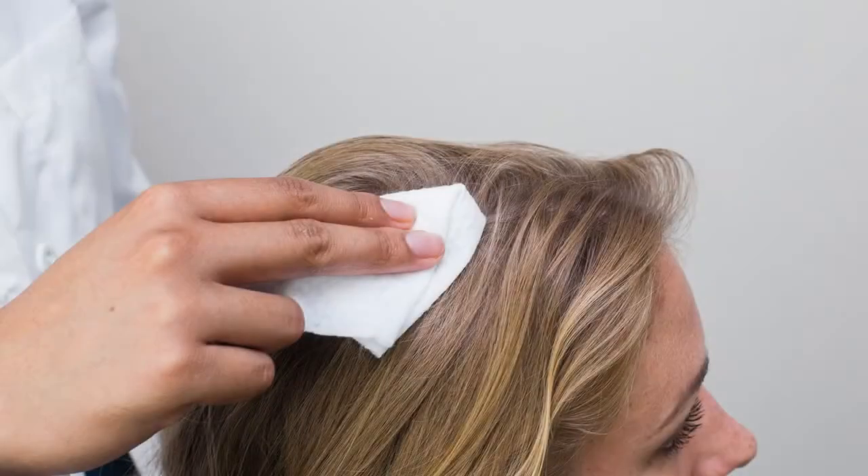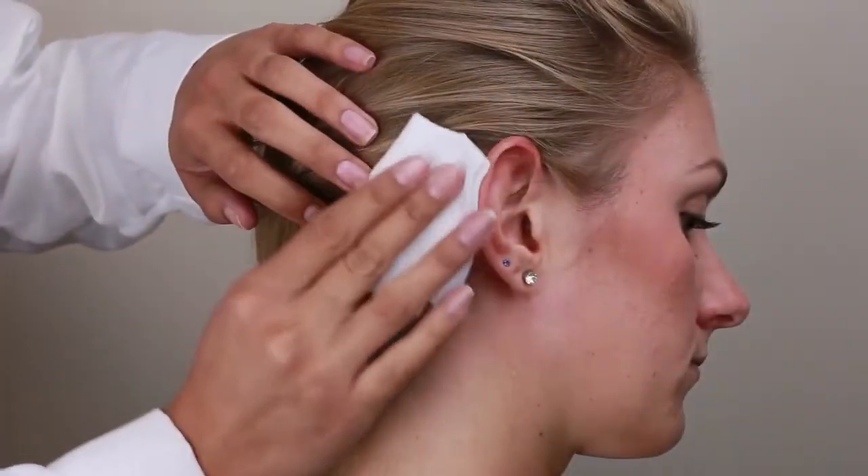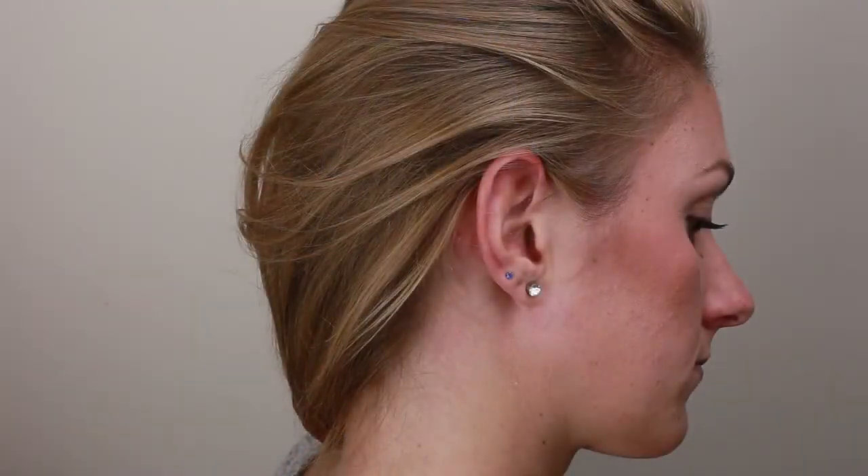Wipe the participant's head with an alcohol swab, making broad and thorough strokes across the scalp, all temporal sites including the forehead and the mastoid bone sites behind the ear, taking care not to cause physical distress to the participant. The alcohol swab is used to remove dirt, natural oils, and hair product residue. This helps reduce impedance values between the scalp and sensor sites. We recommend asking the participant prior to the data acquisition session to refrain from using any hair products, as this is a major cause for high impedances. Before continuing, ensure the skin has dried up at the mastoid sites.